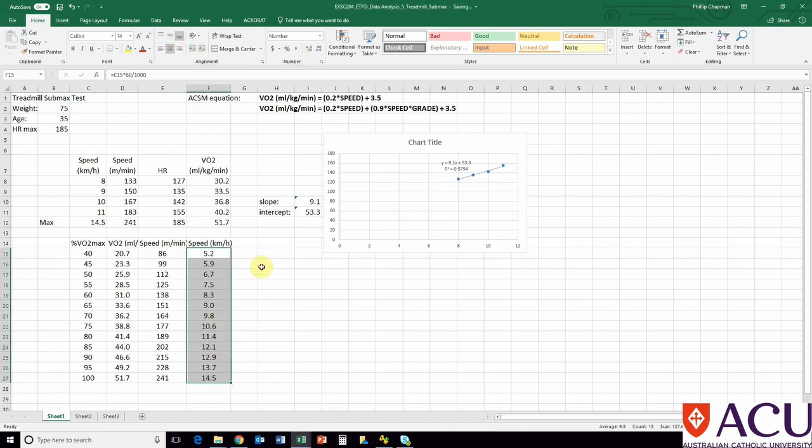So if we came back in a few months, just before the City to Surf, you would expect that this VO2 would be higher and this running velocity would be higher as well. So now he can go out training. You can set a training program. You can say, all right, I want you to exercise between, say, 60 and 70% of VO2 max. You need to run between 8 and 10 kilometers per hour. So you can do that by having a GPS watch, using your phone to see how fast you're running. There are a lot of apps that use those speeds.